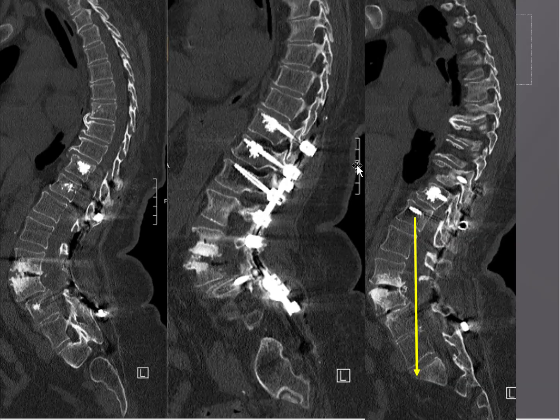Here's the post-op CAT scan. I always order the CAT scan the night of the surgery because if there's going to be a problem, I want to know it right away. If I have to take the patient back, I'd like to do it the next day just to get it over with. And just the measurement, you can see here the plumb line from T12 goes through the sacrum, which is an excellent correction. You can see here at the level of L2-L3, the pedicle subtraction osteotomy, and how much lordosis we got at that level.